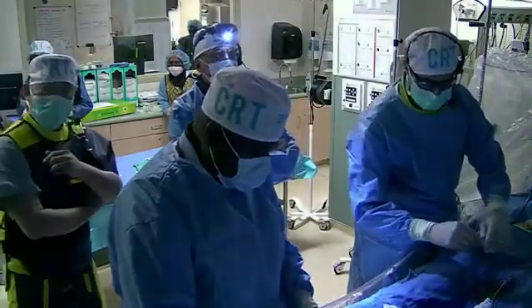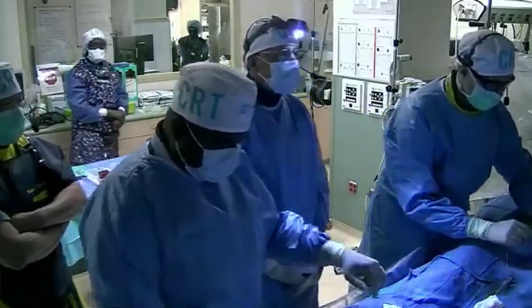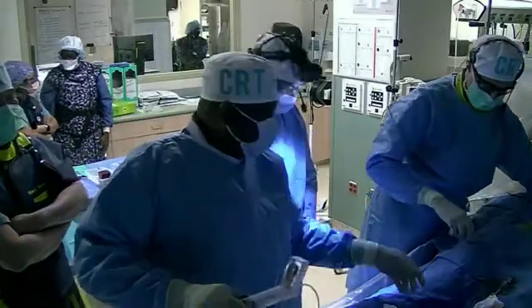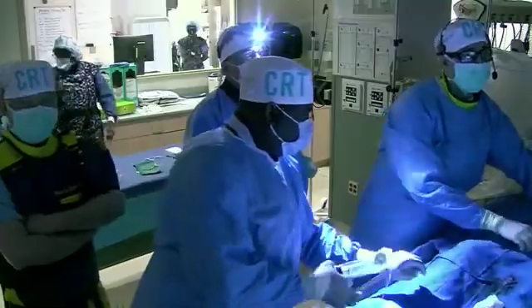Do you have an IVUS? You have the IVUS catheter? Lowell, we know what you're doing. Don't listen to anything we're saying. PCI by committee, it doesn't work. No, it's good. It's good just to have a lot of options, but ignore us. Ignore us. You have the wire, please.